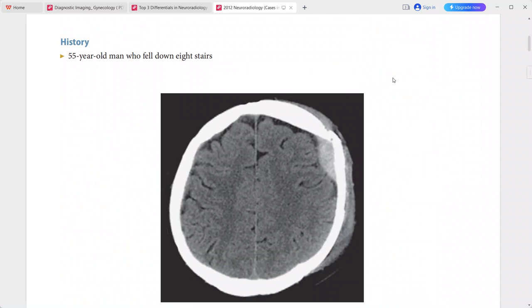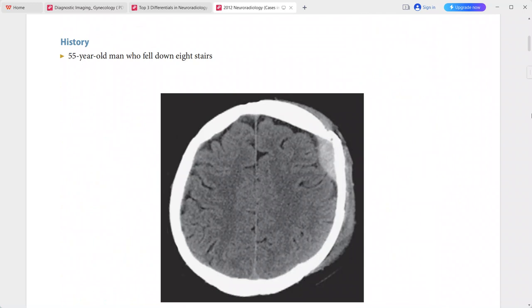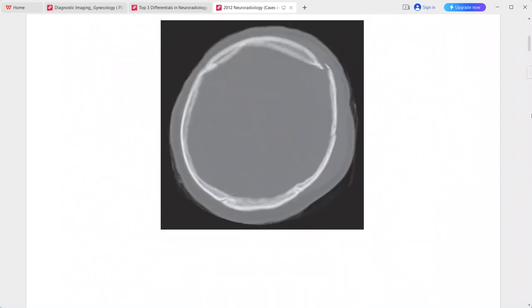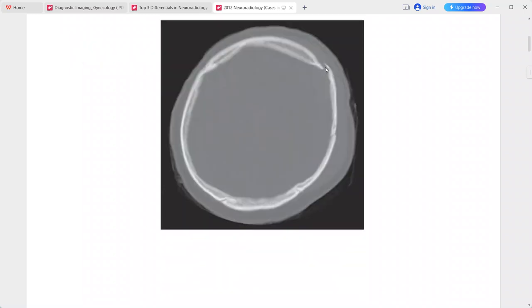Next case: 55-year-old man who fell down eight stairs. On CT, there is a biconvex hyperdense collection in the left frontal extra-axial space, with the brain displaced away from the inner table of the skull. On the bone window, there is an adjacent depressed frontal bone fracture.